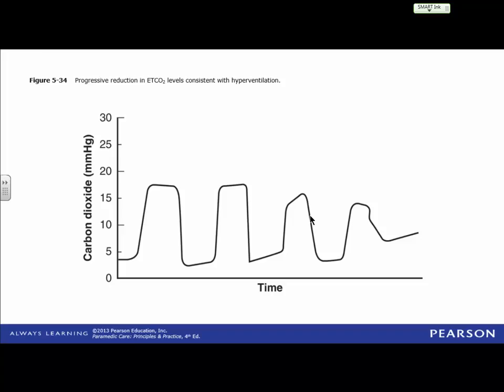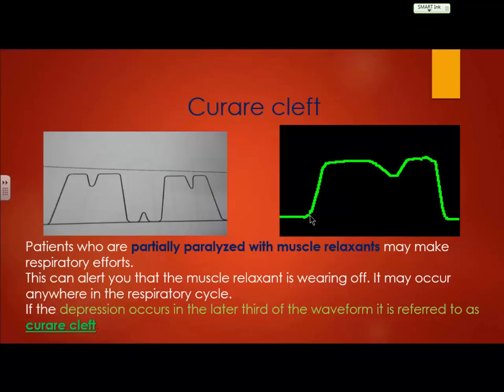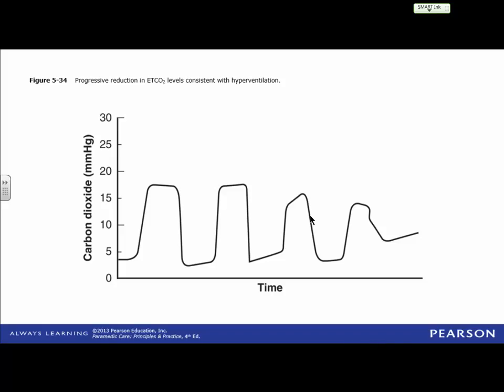Okay? All right? Now, we talked just a minute ago where this could be a visual representation of hyperventilation, but what really is key if you're trying to tell hyperventilation, and I just wanted y'all to think kind of out of it a little bit to relate the numbers here, all right? If this is held constant at low levels, then most likely you've got some other physiological process going on. This is what you would probably expect a little more with hyperventilation.